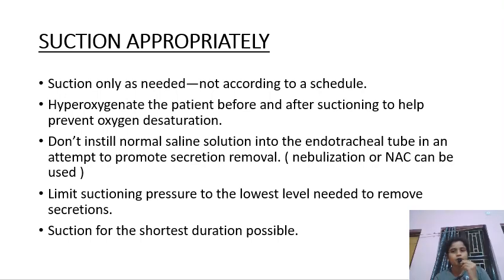So this is part 3 of the series Care of Patients on Ventilator. In the previous two videos we have seen the different care that we need to take in patients who are on ventilator, the supplies, the management strategies, how to check the monitoring of all the parameters of the patient, and about the different pain assessment scales and sedation scales. So in this video we will see about the suctioning part and how to manage the airway.